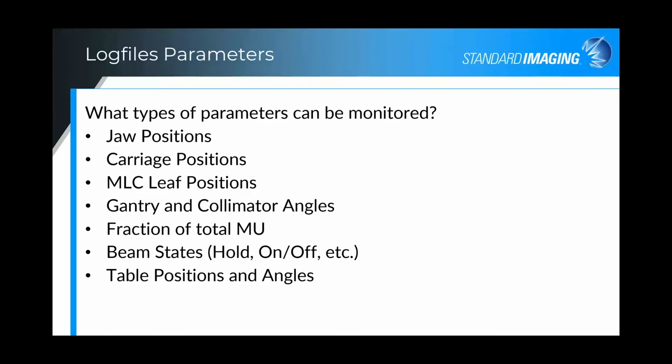And so as a clinical physicist, what do you do with that data? How do you determine if you, in fact, are impacting a clinical difference? One of the things that we can do is calculate the delivered fluence based on the MLC leaf positions and the monitor units.